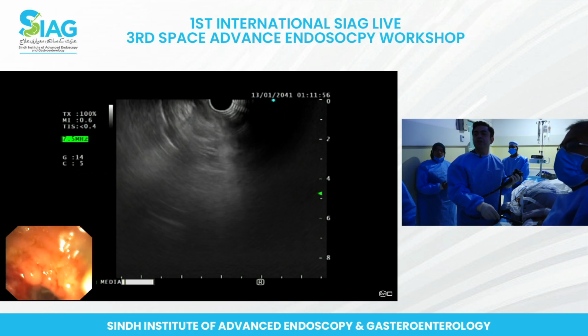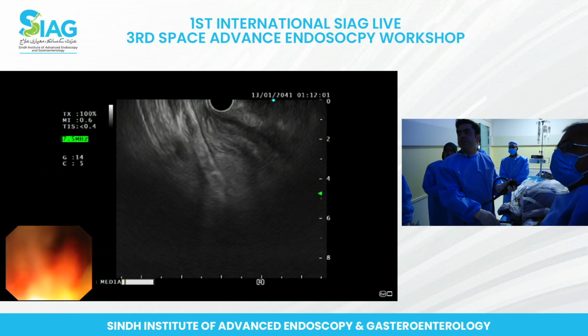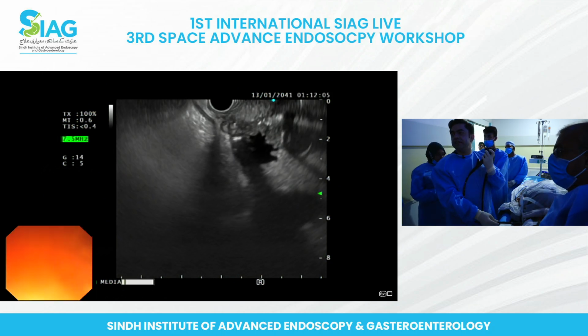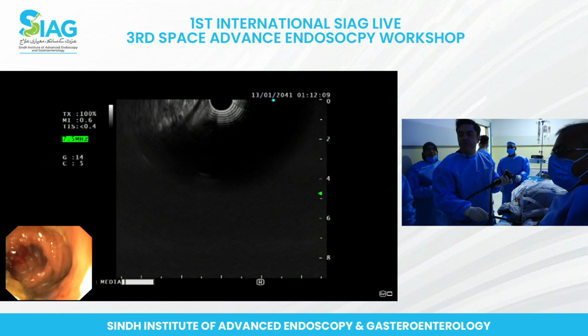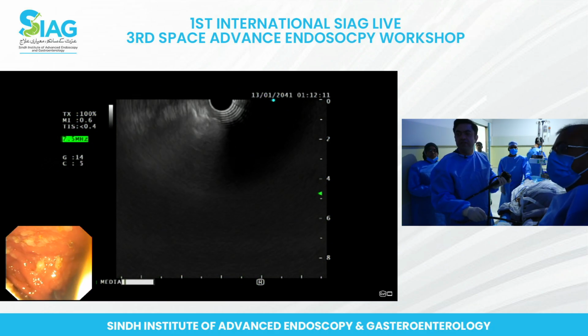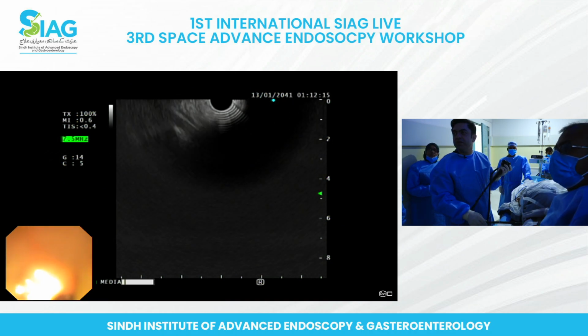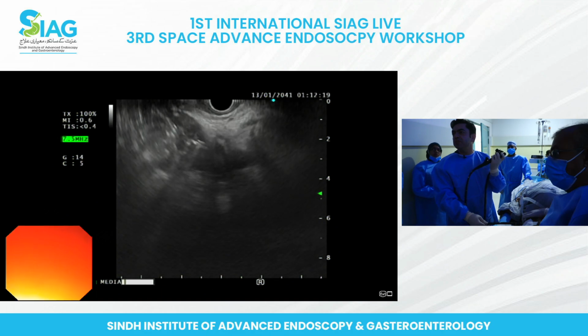That the fluid may have resolved. They did mention on the scan that it looks inflammatory, and they did mention that it's in the lesser sac. So the lesser sac area, I did have a look from the GOJ, and then I've just randomly tried to see, at various levels of the stomach, whether I can appreciate it, because if it was 10 centimeter fluid, we should be able to pick it up.